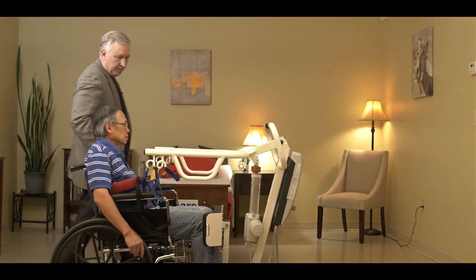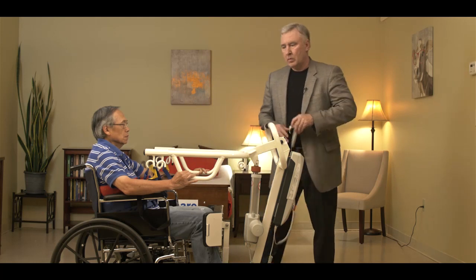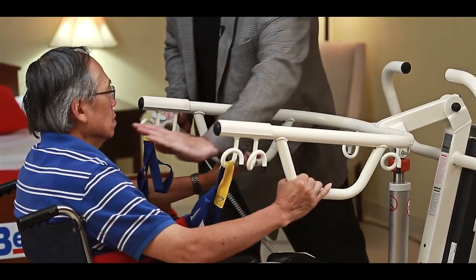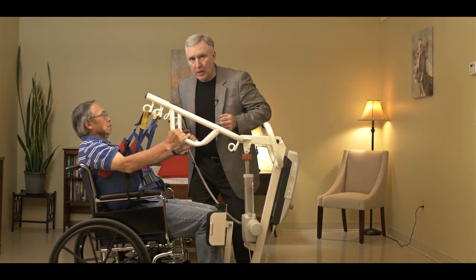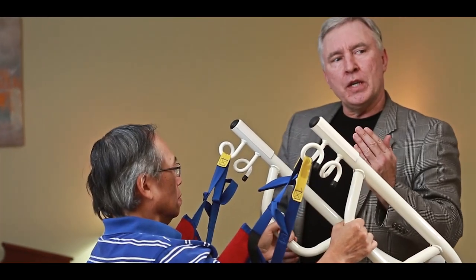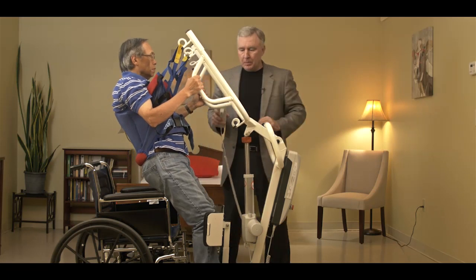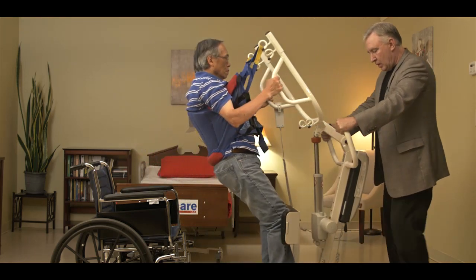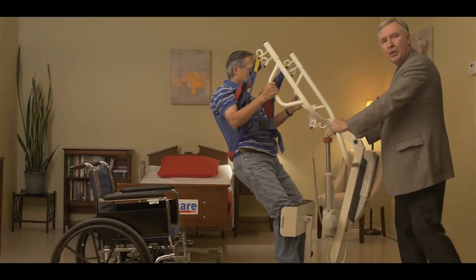With our loops connected, the patient places their hands on the handles. Take the remote, hit the up button, and you want the patient to lean back into the sling as much as possible during the transfer. That's very important — if the patient starts to lean forward and stand up naturally, the belt could slide up underneath their arms. You can see it pulling the person into a standing position. Once in a comfortable position, unlock the casters, take the lift away from the wheelchair, close the base, and transfer the patient to another seated position.